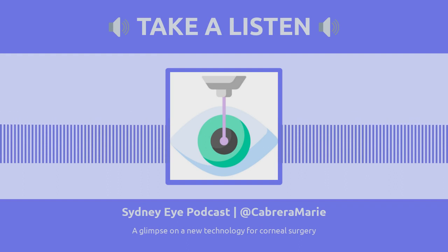Because once it's charred, we move it away, and it hasn't really caused any problem, because the experiment that we did it on was on a dead eye, so they're not live eyes anymore. So we don't know whether we're scarring down the track. But the very important thing is when you're operating the laser, you have to be very, very careful.